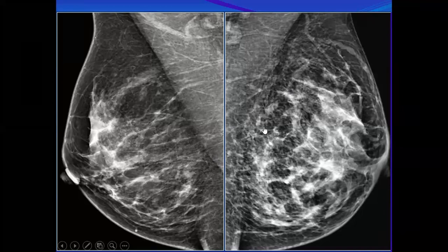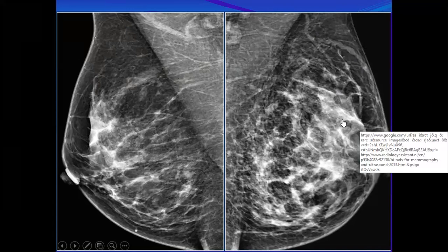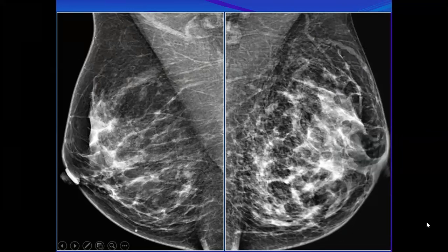When you see breast edema extending to the prepectoral region, it is significant and gives a little bit more suspicion. Also, if you look, there is increased vascularity. Compare the two sides. Yes, there is increased vascularity and it is diffuse. So we are dealing with malignancy, I think. Suspicion. Yes. I will go for BIRADS.